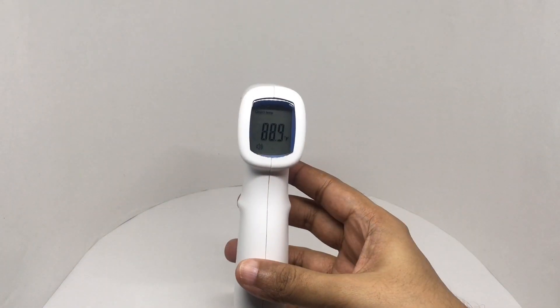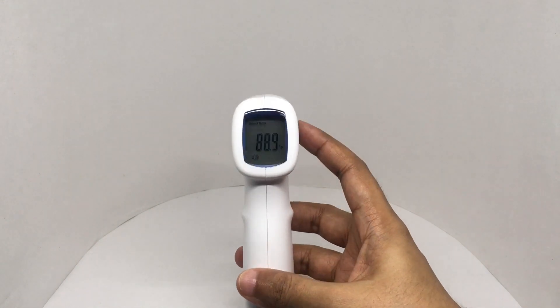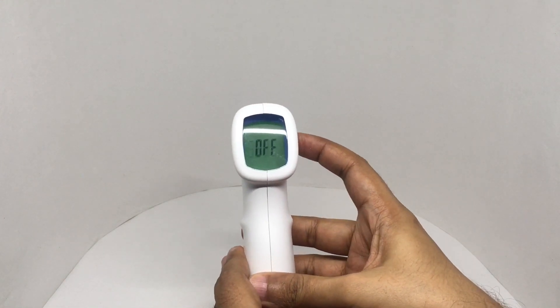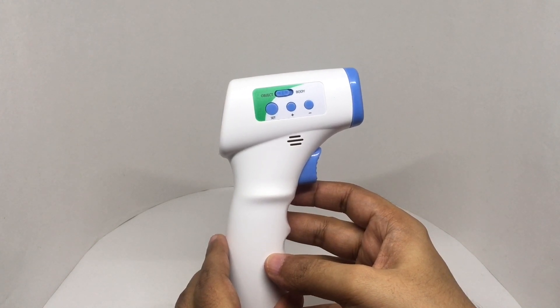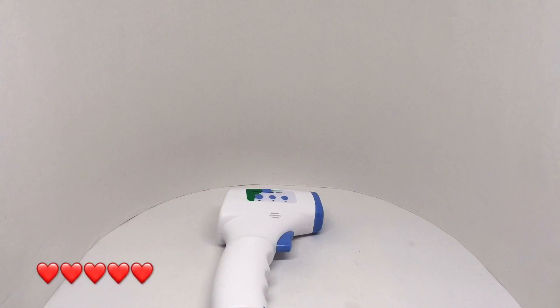The display turns off after 60 seconds, or you can turn it off with the settings button. That's how you change the temperature setting. Quite an interesting and really useful product — check it out.